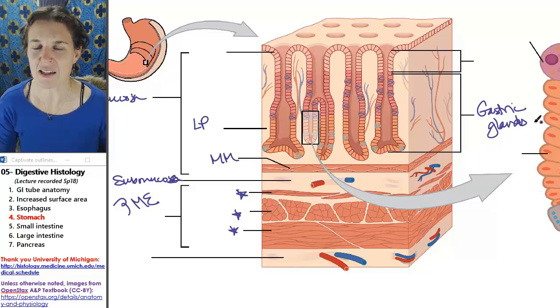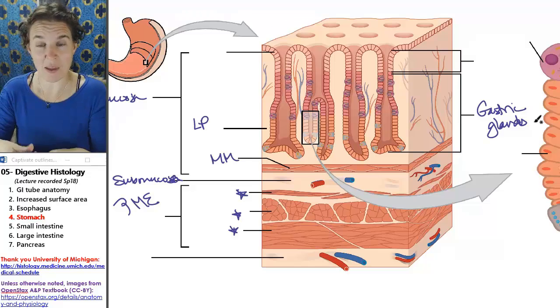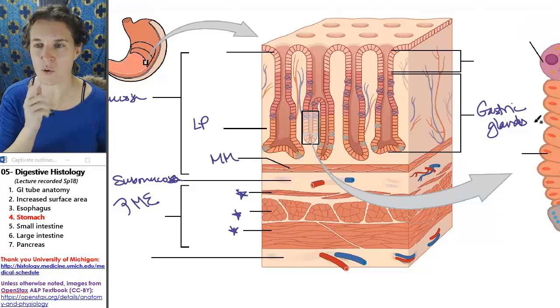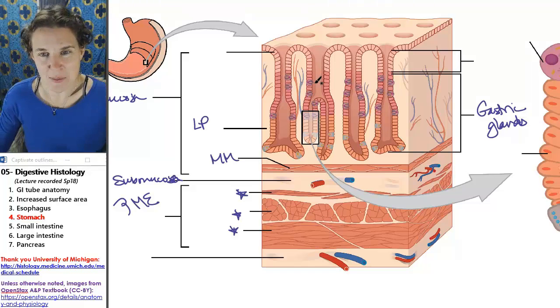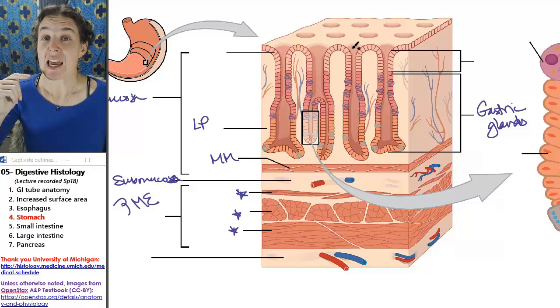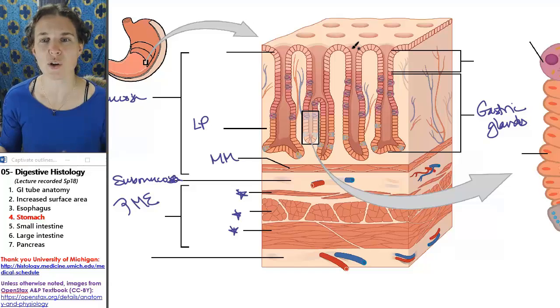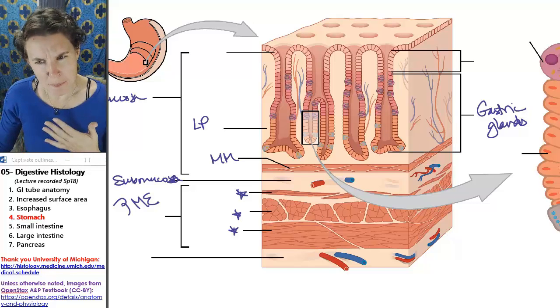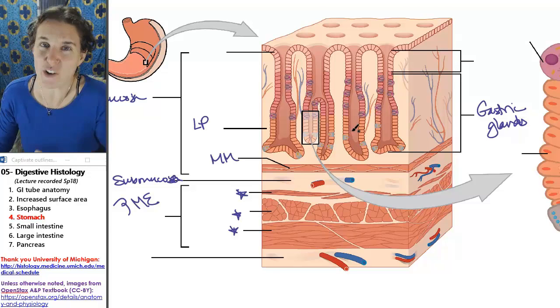And the glands are down in the lamina propria. They're producing substances. I'm going to show you a picture of a gland and talk to you a little bit about what they're producing. And then the substances that they produce are being secreted into the lumen of the stomach up here. So the lamina propria of the stomach looks extremely glandular. The tissue looks puffy to me, and I'll show you when we look at the slides. And sometimes it looks like there are villi, and there aren't villi.